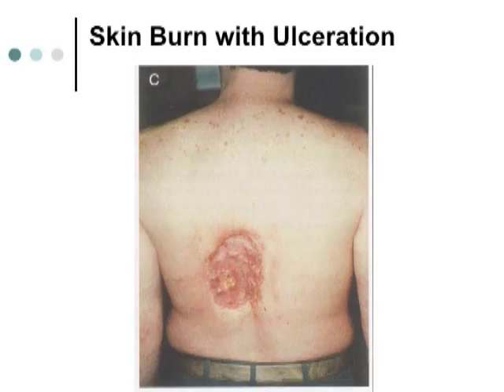Hypersthenic. Okay? He's a big guy. Now, C-arms have the ability of going into something called the boost position, or high-level radiation, where the amount of radiation given to the patient can be 4 times as great. You got a big patient like this, they're going to take more radiation. They're thicker, right? So the difference between doing a 90-pound person and a 400-pound person is the amount of mass you're going to use, right? The MA that you're going to use, because they're going to absorb more.